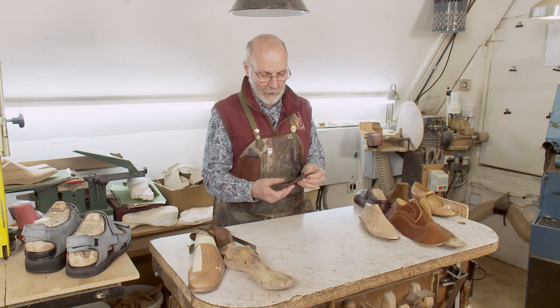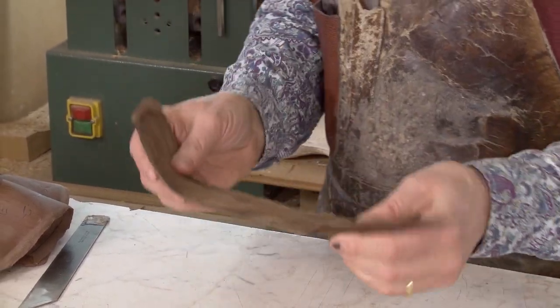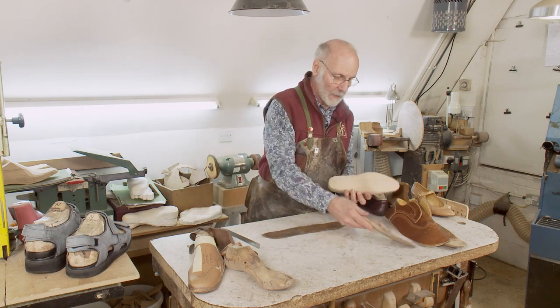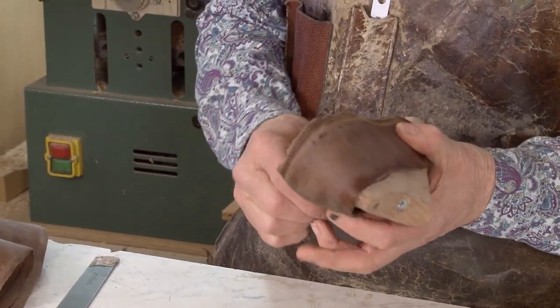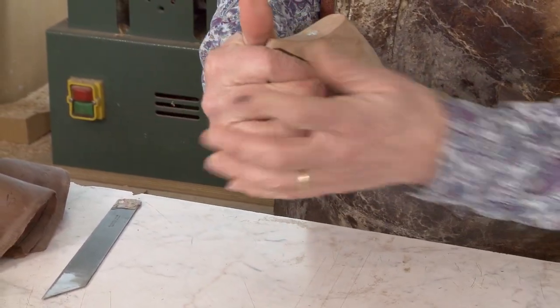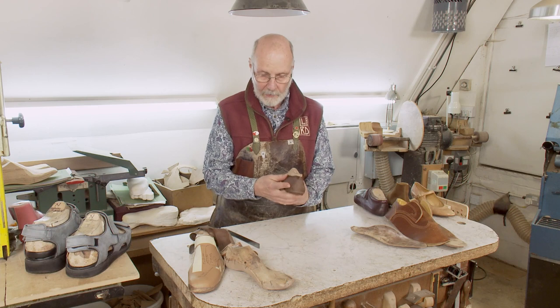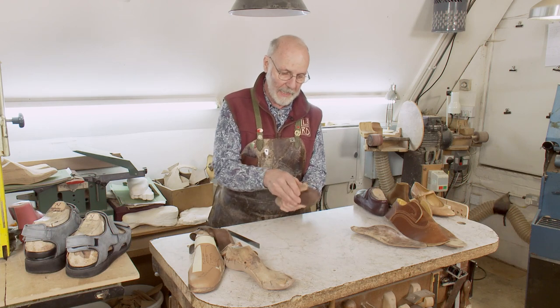Stiffeners start off as a piece of oak bark belly leather. When it's wet, it's totally malleable — this has been soaked for quite some time. So it's shaped to fit onto the last. You can see here it's a long stiffener, so it's going to go all the way around the outside and all the way around the medial and lateral side. You can see how that's going to support the foot all the way along. That's good for somebody with hypermobility because it really contains the foot.